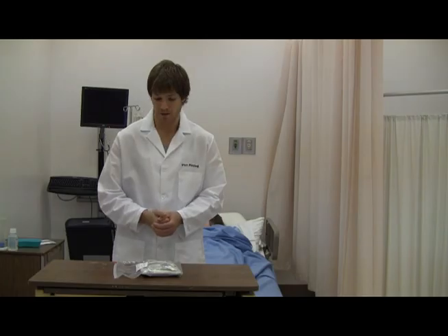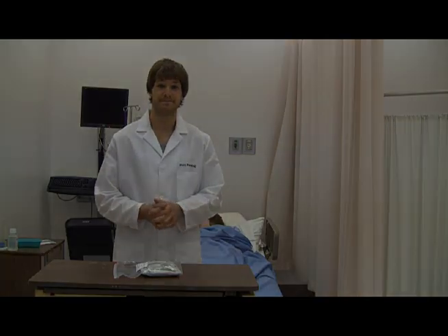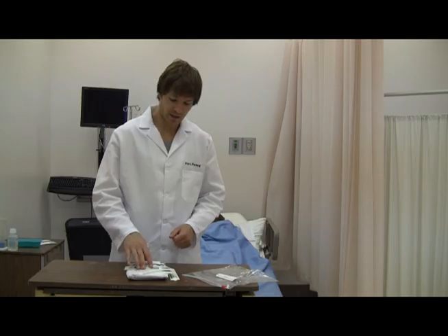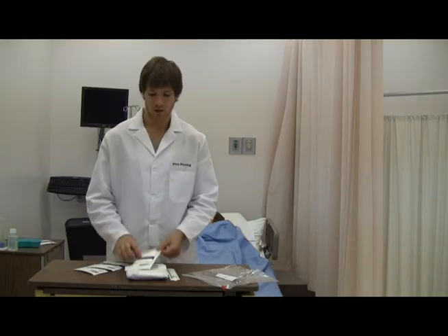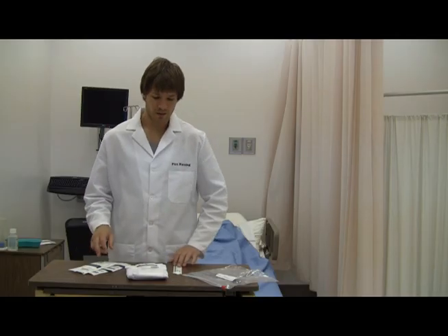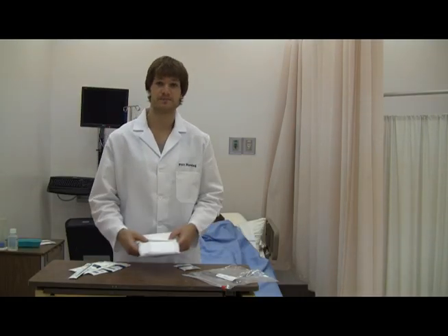Everyone, I'm Joe. I'm going to show you a little bit about creating a sterile field so that you can put your sterile supplies on the field before you put your sterile gloves on. Okay, so inside your kit you have two 2x2s, two 4x4s, one combined ABD, one sterile Q-tip, and a sterile towel. It doesn't matter if your towel is blue or white.